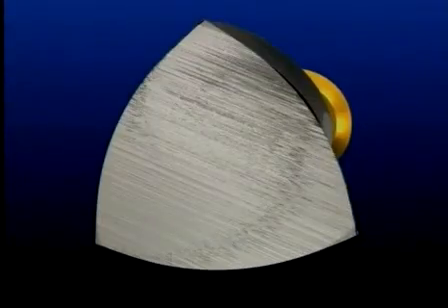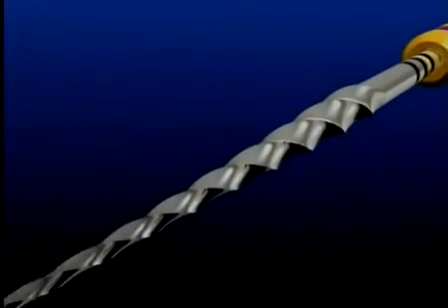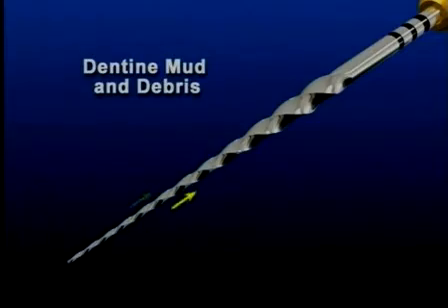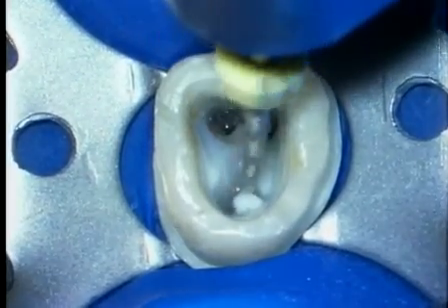Another unique feature of the ProTaper instruments relates to their convex triangular cross-section, which reduces the contact area between the file and dentin. This greater cutting efficiency has been safely improved by balancing the pitch and helical angles, which in combination prevents the instruments from inadvertently screwing into the canal. All the ProTaper instruments effectively auger debris out of the canal. Generally, only 3 instruments are required to produce a fully tapered canal that exhibits uniform shape over length.